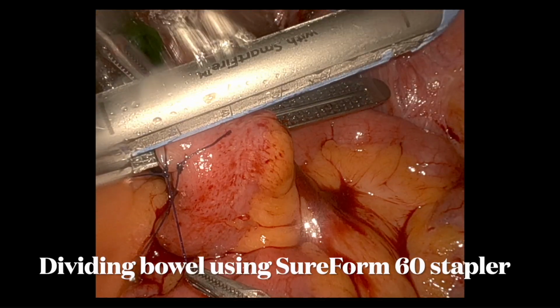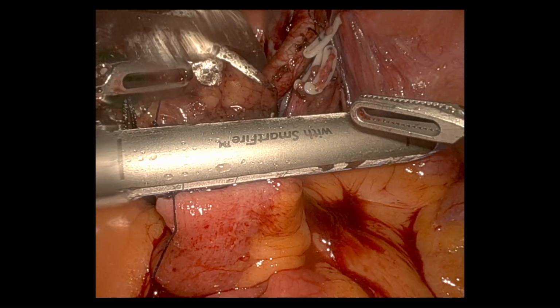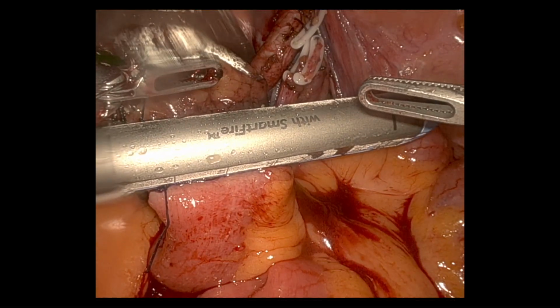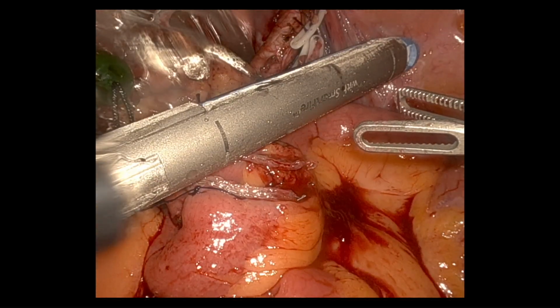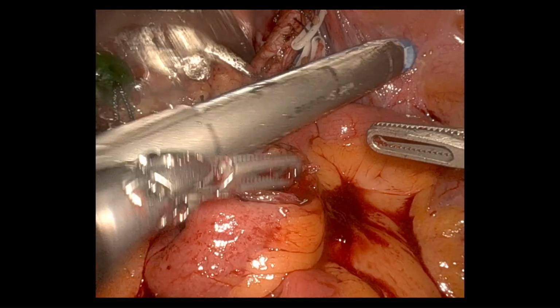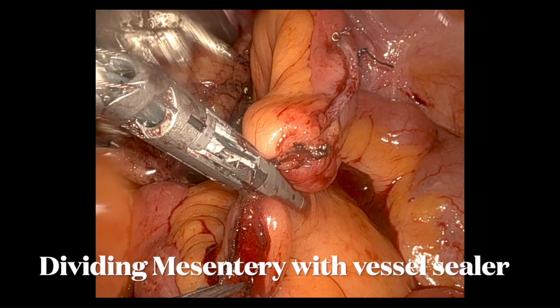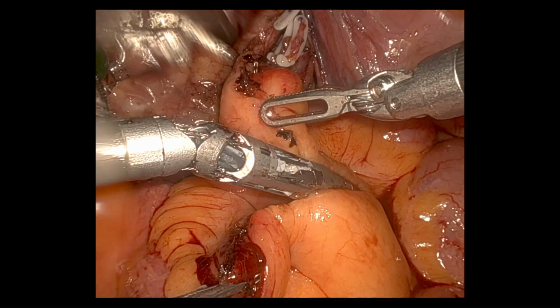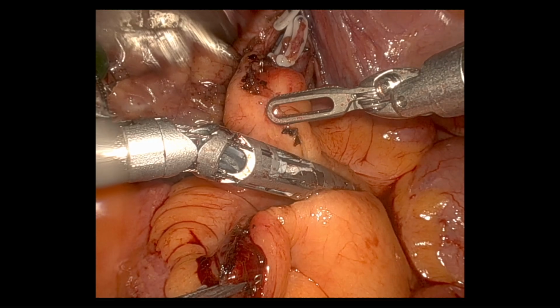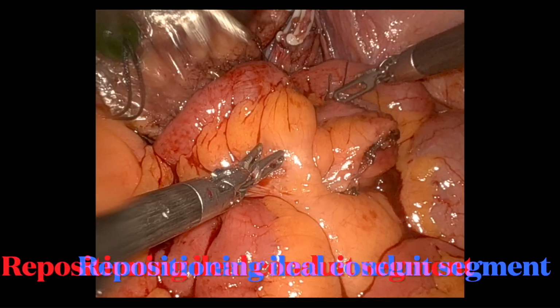We divide the distal end at the stay suture site using a Sureform 60 stapler, followed by division of the mesentery at the same level with the vessel sealer. We position the ileal conduit segment posteriorly and bring the distal end of the bowel anteriorly.